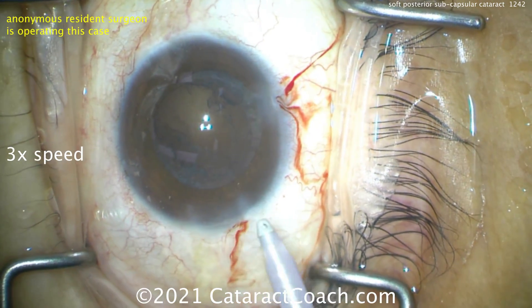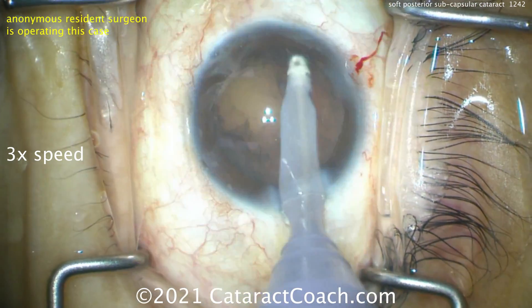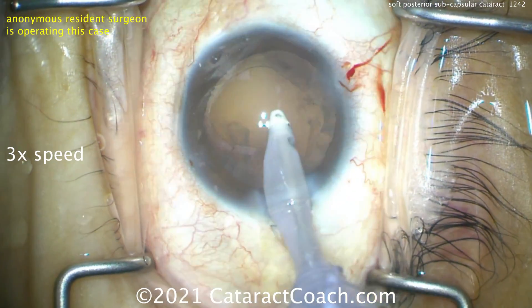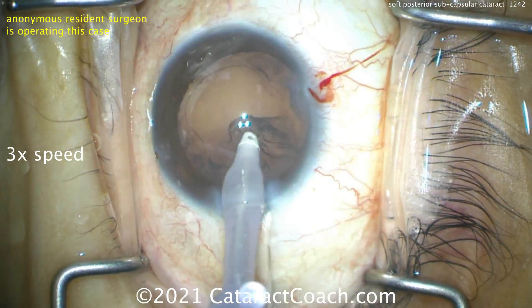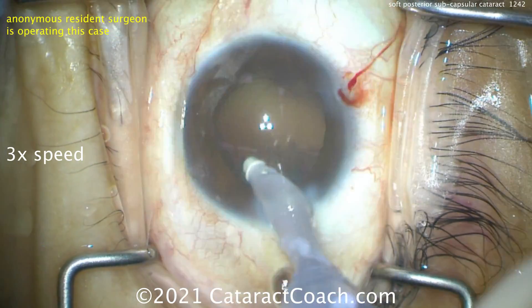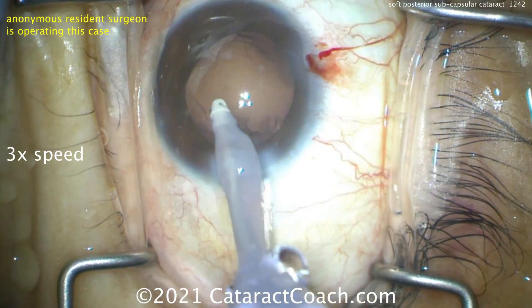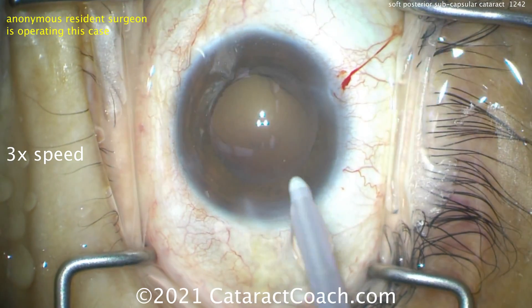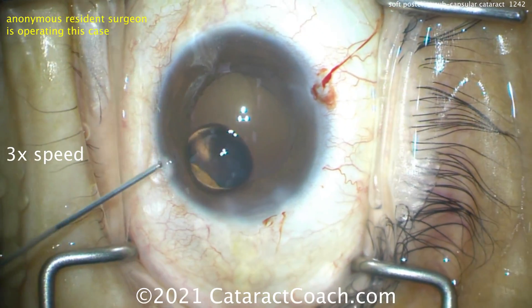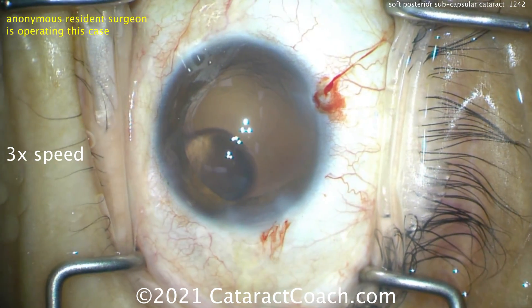In this type of soft posterior subcapsular cataract — it's not butter-butter soft, but it's soft enough — you want to get it out of the capsular bag. Because the central endonucleus is small, even though the rhexis is only about five millimeters and a little irregular, you can still easily and safely prolapse the nucleus out of the capsular bag. You don't have to operate in the capsular bag. When the lens is on the soft side, it's sometimes tougher to operate within the confines of the capsular bag because you may damage that posterior capsule.